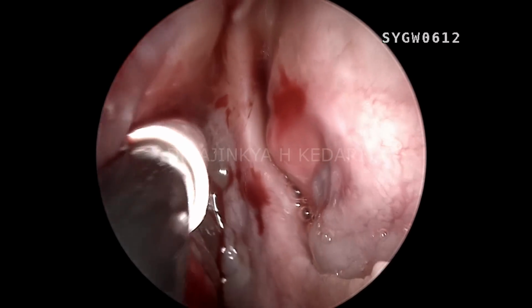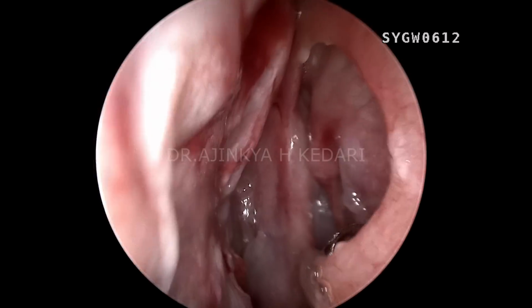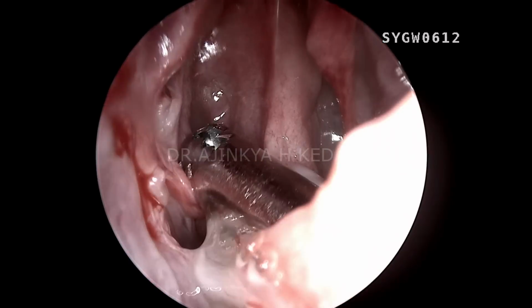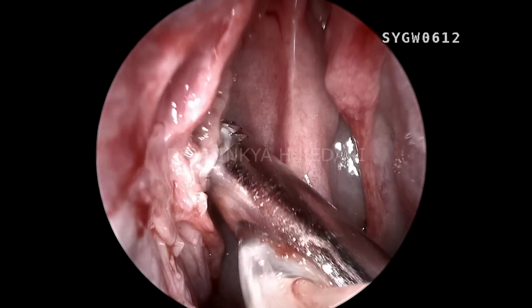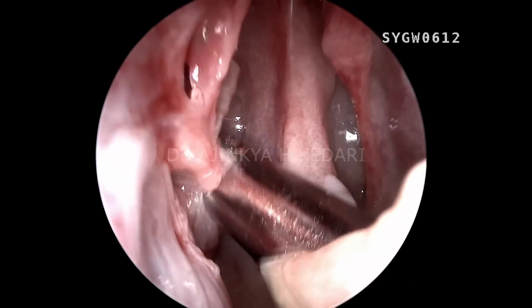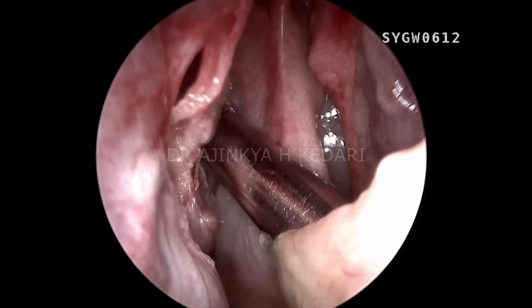You can see there's a sphenoidal area where usually the ostium is. You can see there's a lot of polypoidal tissue. So what I'm doing right now is coming with the debrider from the patient's left side through that opening done by the previous surgeon.